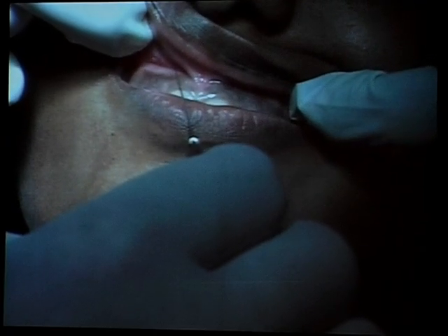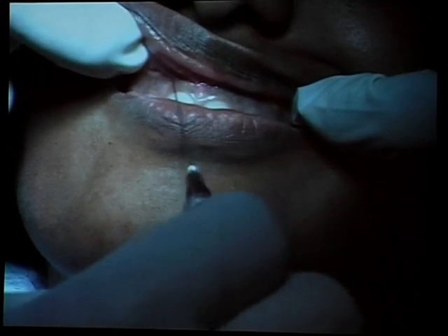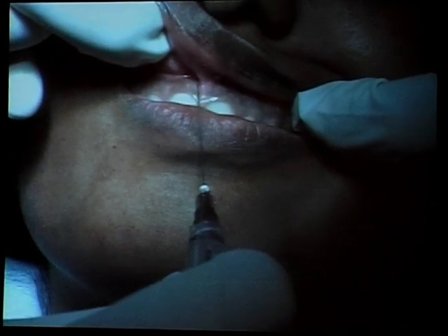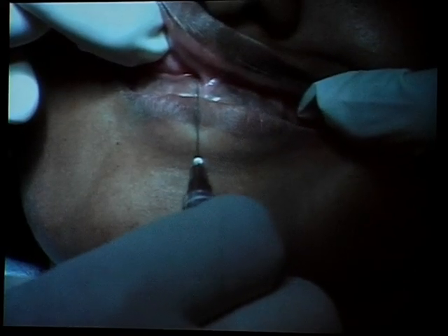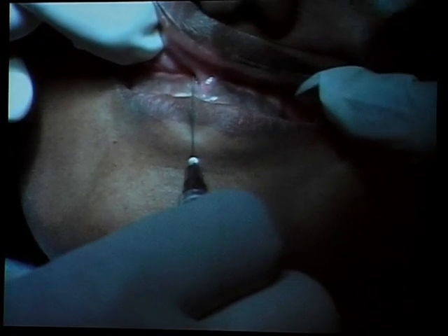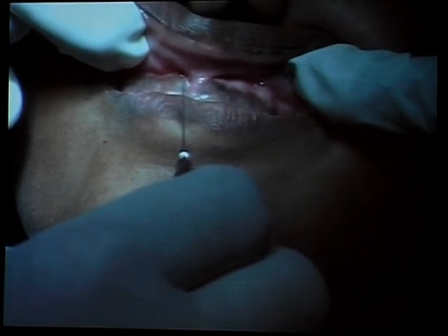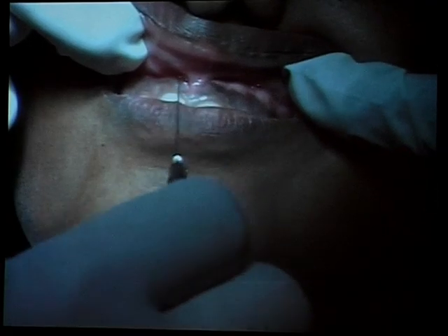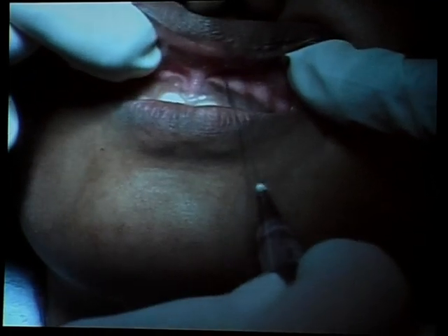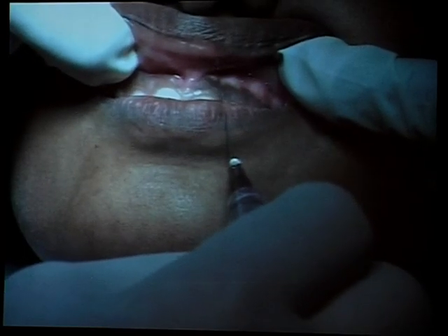You really don't need anesthesia if you're going below 2 watts, normally 1.5 watts. So normally, if you start to do procedures, start with lower powers. It's always better to start at lower powers, and if it won't work, you can increase the power. But don't start with high powers, otherwise you may burn the tissue directly.